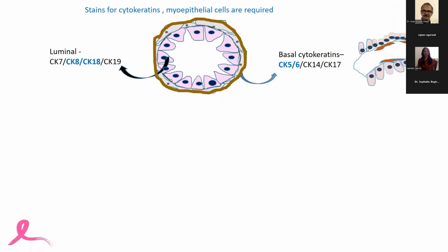So just two things that everybody who practices breast disease needs to know, that we use two stains very commonly. One is cytokeratins and the second is the myoepithelial cells. Now, why do we use cytokeratins? I mean, it's frankly epithelial. What is cytokeratin? They stain the epithelial cells.